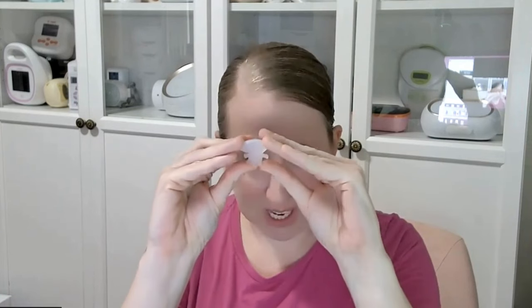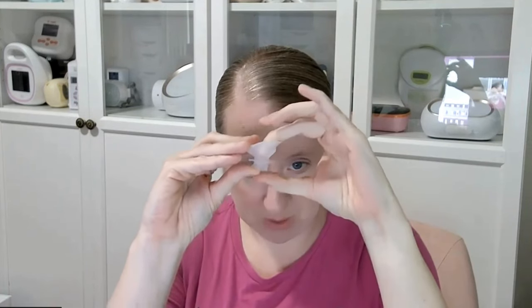So it did come with quite a few inserts that are designed for the 28 millimeter flange, or 27 millimeter, I can't remember exactly. I think it's 28 on this one. Sorry, I always get that number confused. This insert looks like it's a normal size, but let me bend this down so you can see how much actual length you have. From the top of my finger to here is the length. That is not long enough. The average nipple is going to pull right out the back of this.